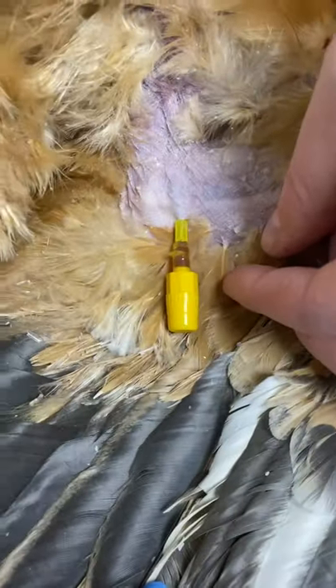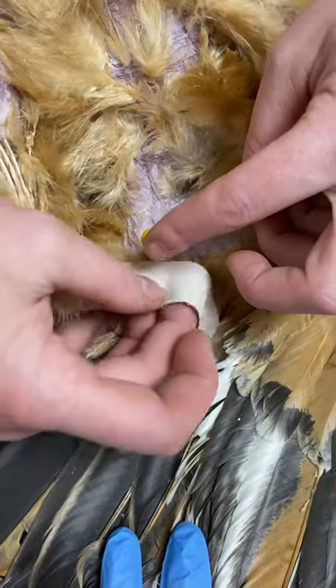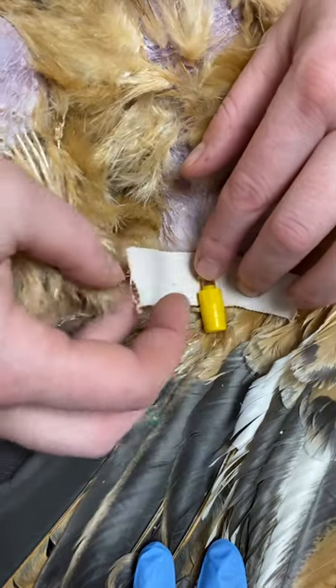We have our catheter in place, our bung is in place, and the next step is that we're going to tape it in place. So we lift it up and lie it on a little bit of elastoplast, and we are going to turn this into a little butterfly.